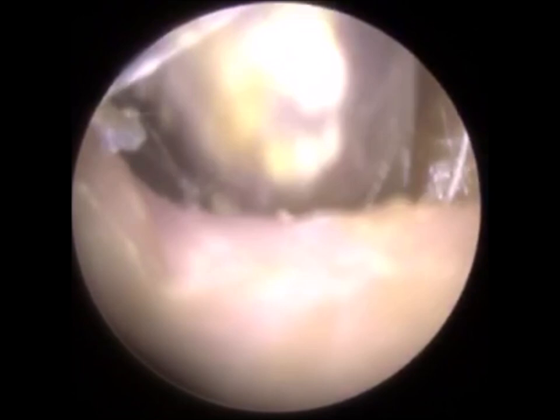With this suction probe, I'm just trying to get a grip, really tugging at this. As I said before, it's like chewing gum in the ear. There's no better way of explaining it. It's very elastic, almost like a rubber band consistency. You're pulling the rubber band and someone's holding it on the other end and it just doesn't want to let go. So I've gone in with the Jobson horn. I'm just trying to get in behind and separate this and get around this big plug, almost like a spade or a shovel, to pull this out. I've got a little piece there. Just going to re-enter again.